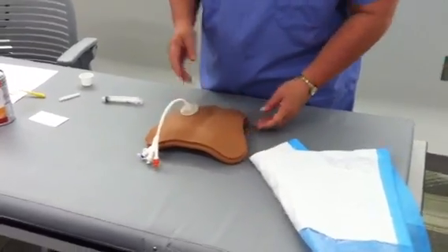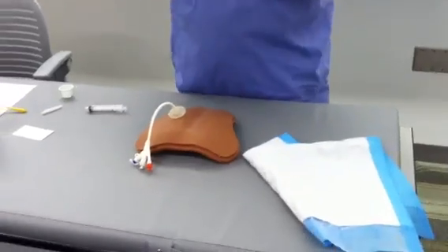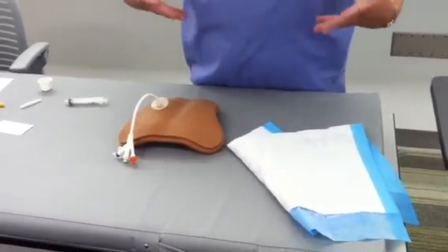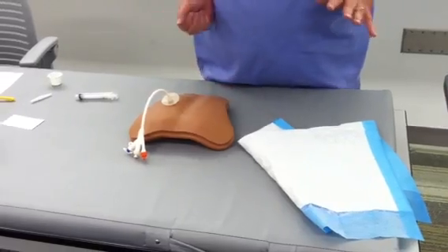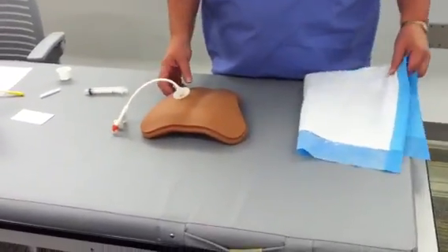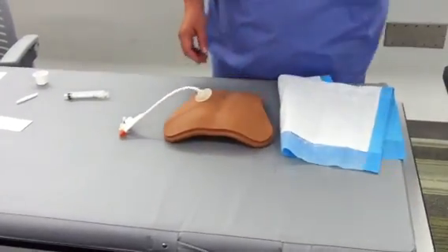Okay, very good. I'm just going to take a look at your abdomen, and you could have done this before you even came in the room. I'm just going to take a look, and you're going to assess that there's no abdominal distension. You're going to assess that the patient has bowel sounds. Okay, first I need to check and make sure the tube's in the right place.